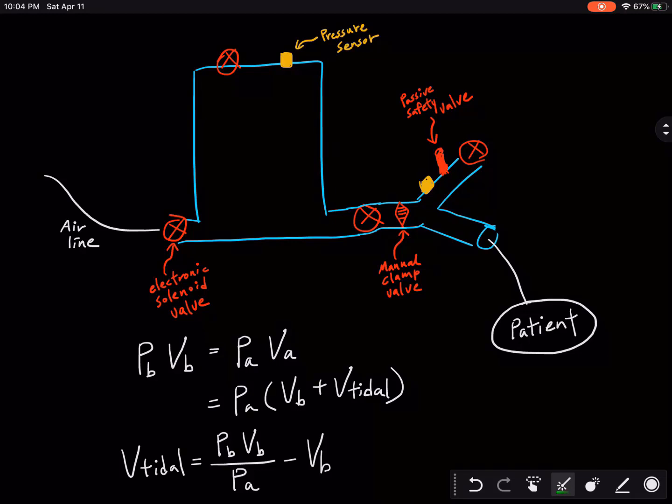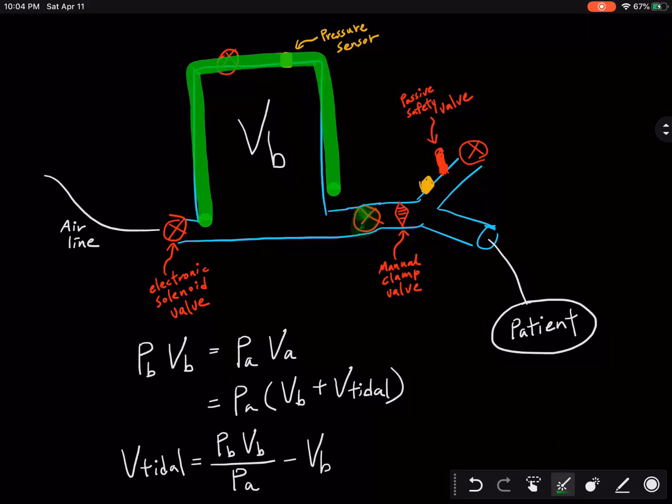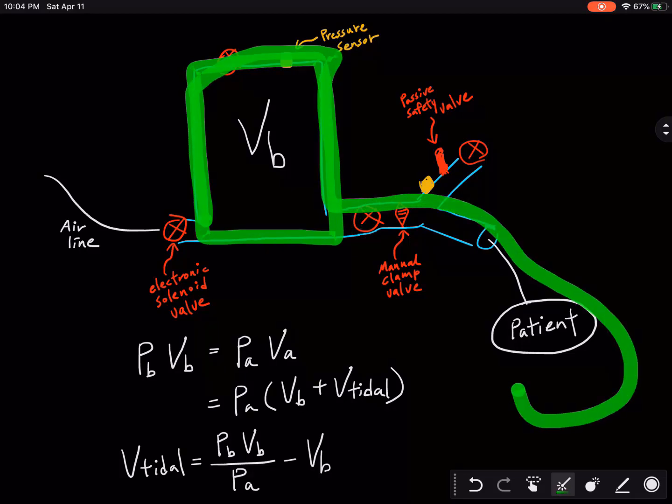So in this design, we take in compressed air from the airline and store it in this Windkessel here. The Windkessel has a volume VB, and it has a pressure of PB that's measured by this pressure transducer. Now when we want to push this air to our patient, this valve opens and the air that's in here expands to fill the patient's lungs.